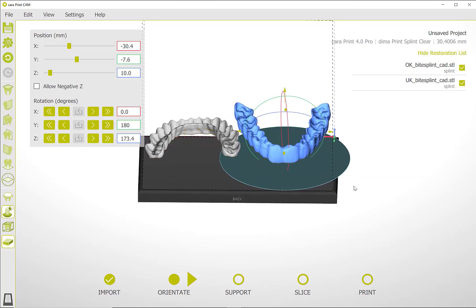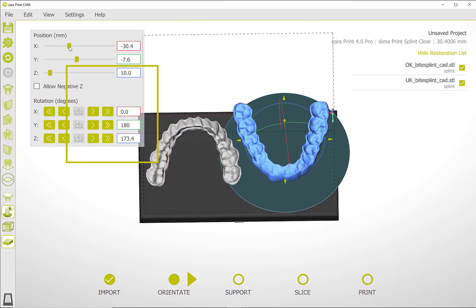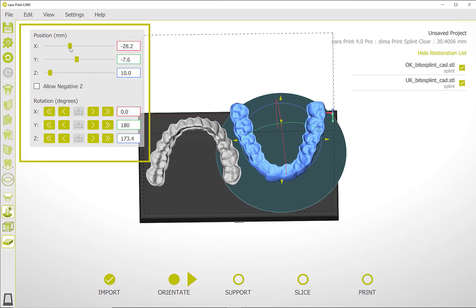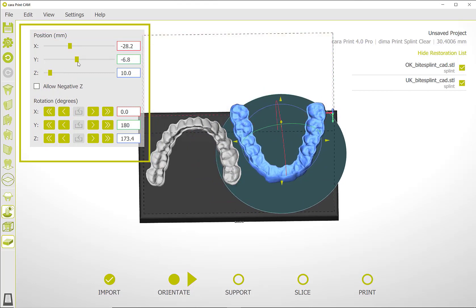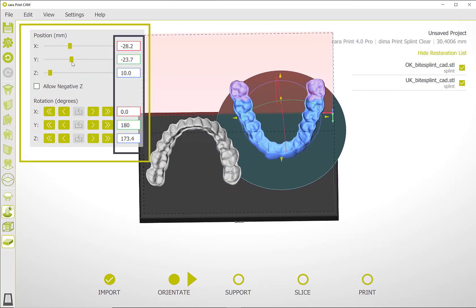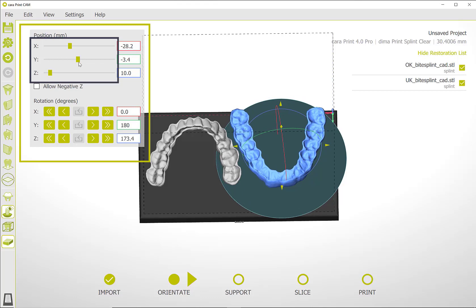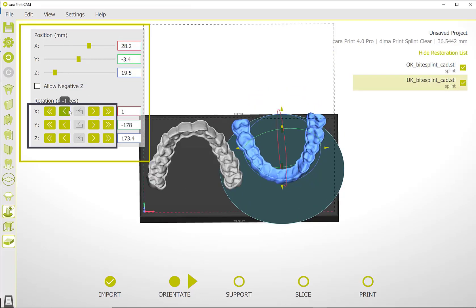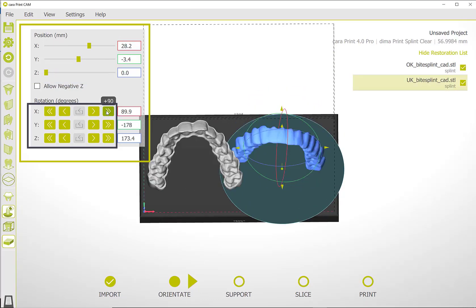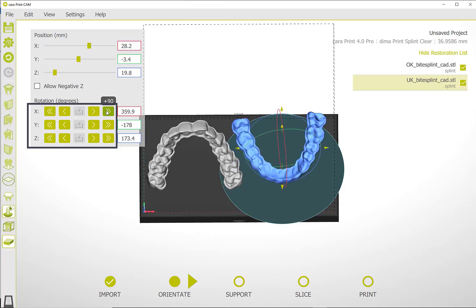The object can be moved using the display field in the upper left area, both by entering numbers and by moving the sliders or clicking the arrows. Both 90 degree increments and single degree changes can be made.